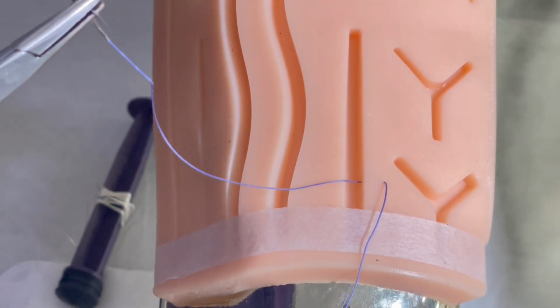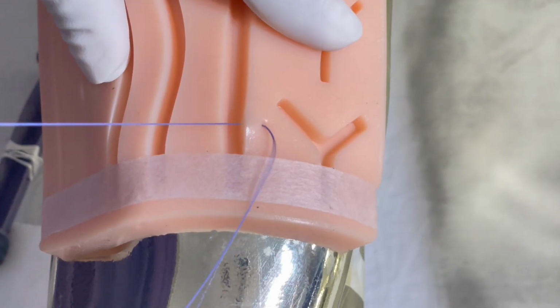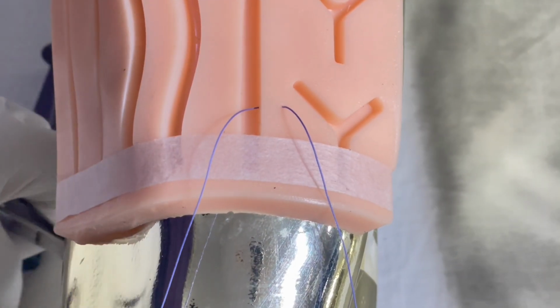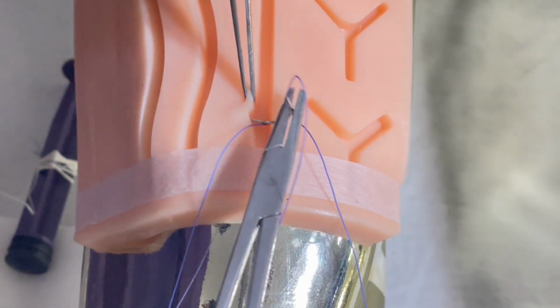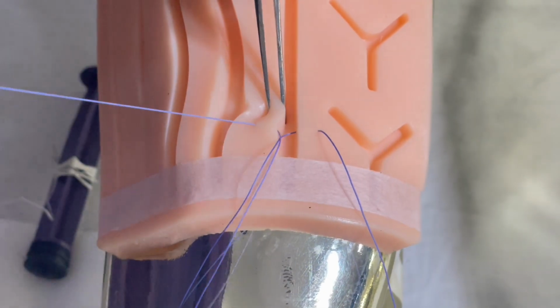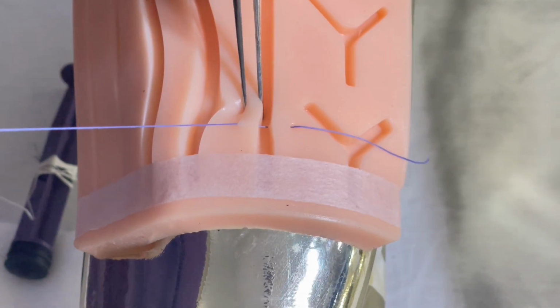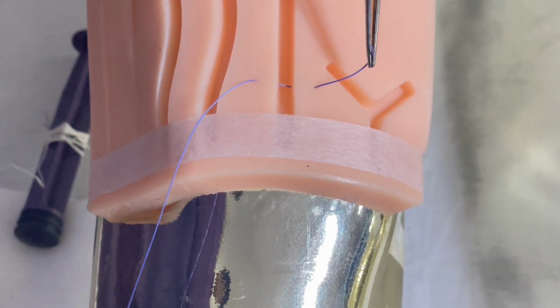If you have two plain forceps, it will be easy to catch it. Then you remove this side, then on the opposite side, around 2 to 3 centimeter of this end has to be there.